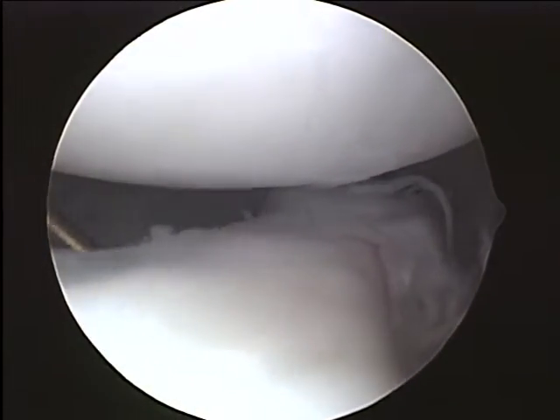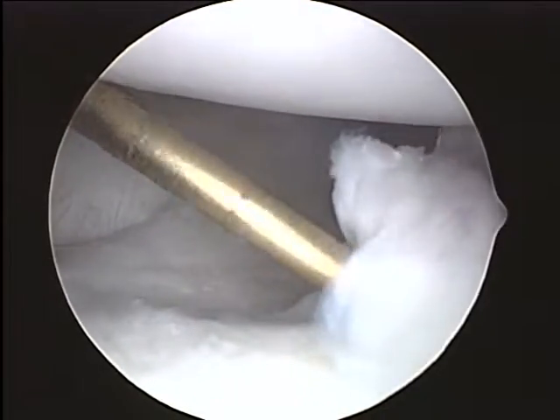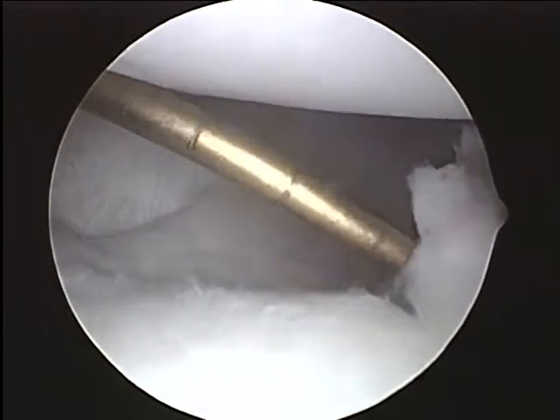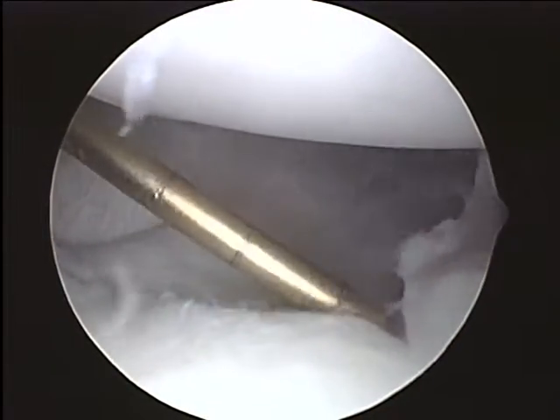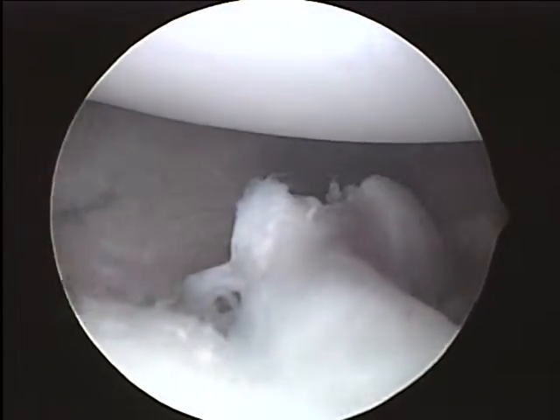You do have a tear of your inferior labrum down here. So up with the arm again, please, Trish. This tissue down here, you can see how that can be catching back and forth in the joint. So that's certainly a source of mechanical irritation. That's not contributing at all to your stability of your shoulder. So this, for sure, we want to take out, and that should be very amenable to removal just with the arthroscopic shaver.